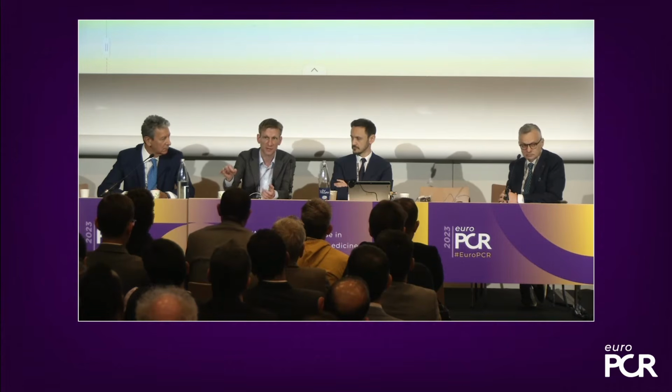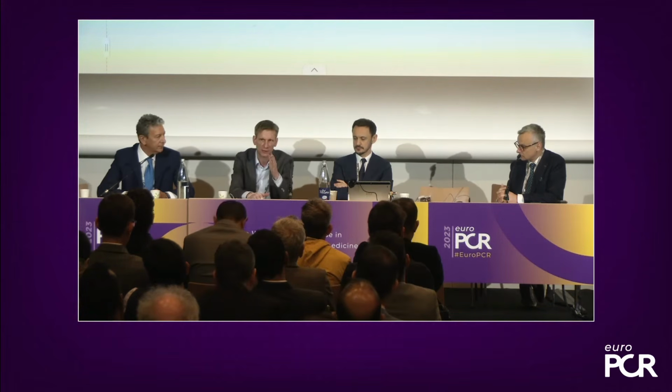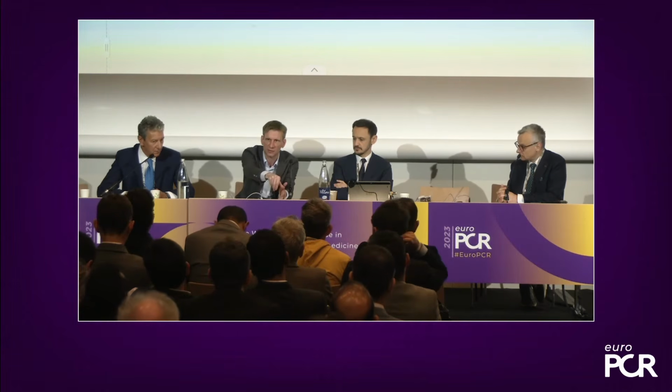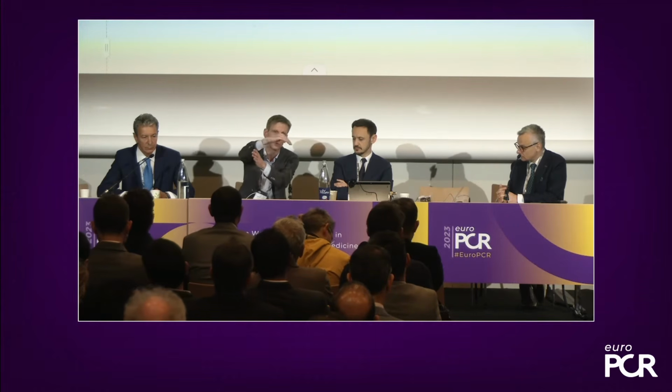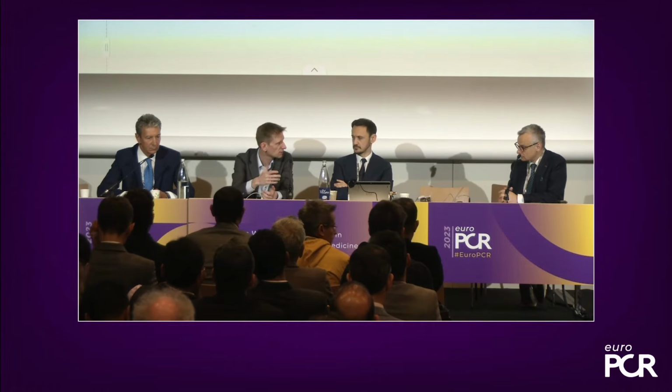You're like 3 centimeters too low. Then you know immediately, and you don't have to explore there with your echo. Put it higher up, and then you already know, okay, that's the spot of the correct height. That's where I'm going to put my echo. And then you can even check it longitudinally, if it's correct. You see that you're away from the bifurcation, away from the diving part, and then you go to your short axis. That can help you avoid making big errors, I think.